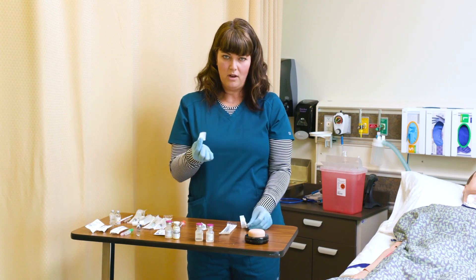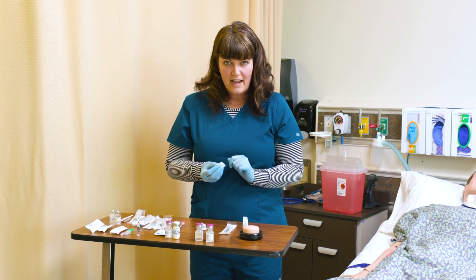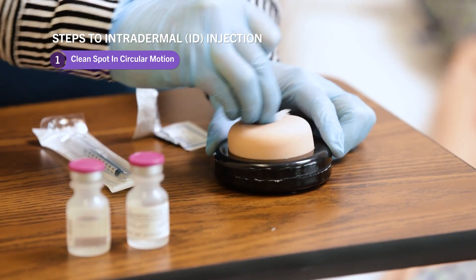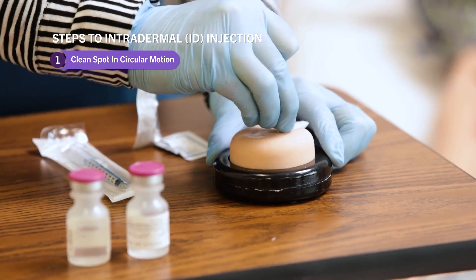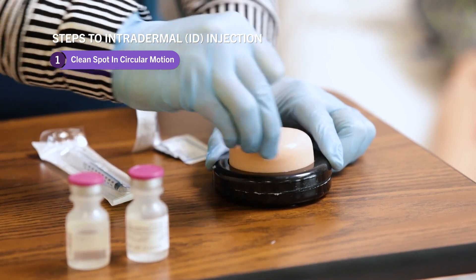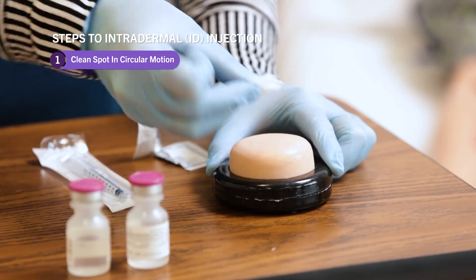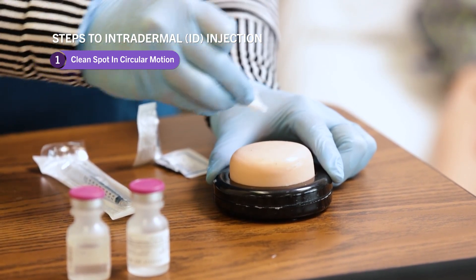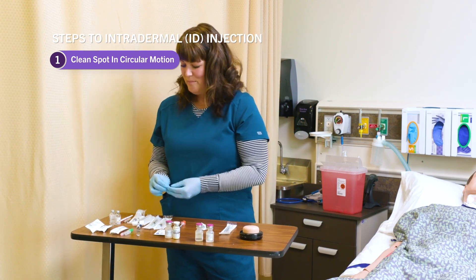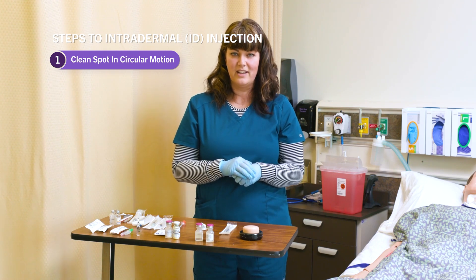With the alcohol, we clean a very specific way before an injection. We choose the site of the injection, start at the center with alcohol, and clean in a circular motion — starting in the center and working outward in larger and larger circles. We never want to go back from the outside to the center again, because we'd be pulling contaminants to that injection site. We also never fan or blow on the site to dry it; we just wait for it to air dry.